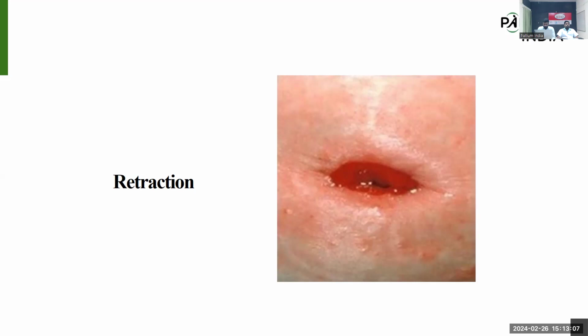So this type of colostomy bag base plate, or the wafer, will be the convex type of base plate. On that we can attach the colostomy bag. Mainly, for 14% of the colostomy cases, this retraction is normally reported.